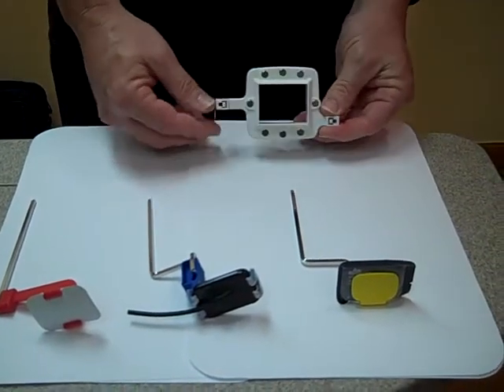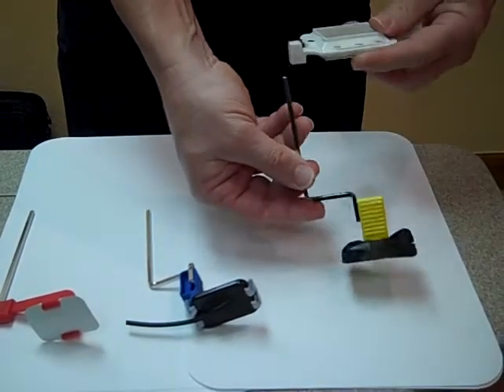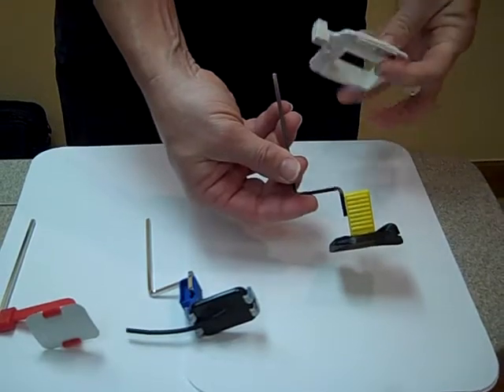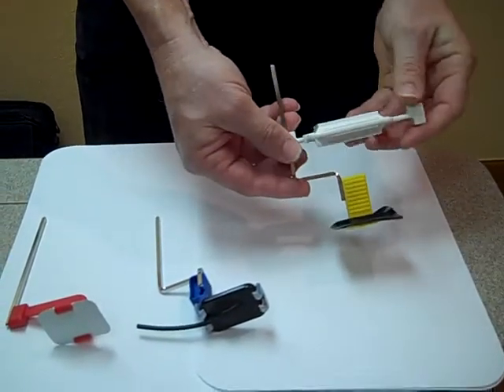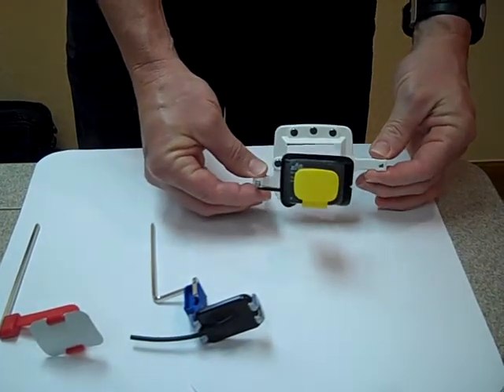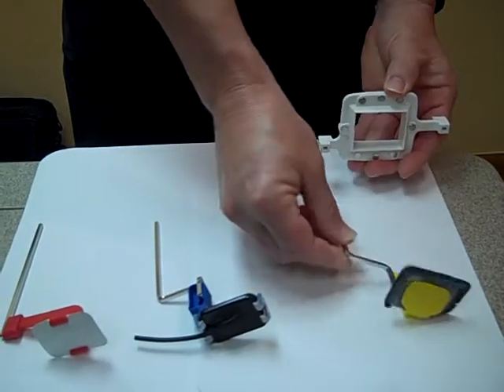To set this up, you take your positioning device and simply slide the bar into the alignment ring, and you have perfect alignment every single time. Slide it out.